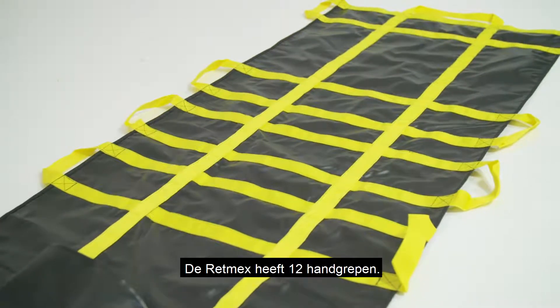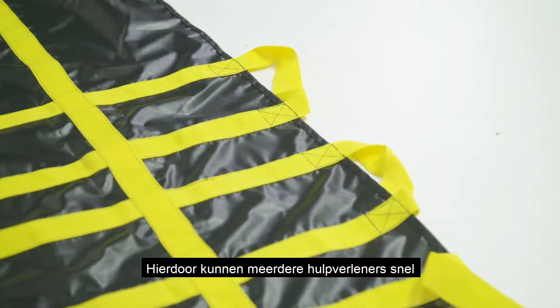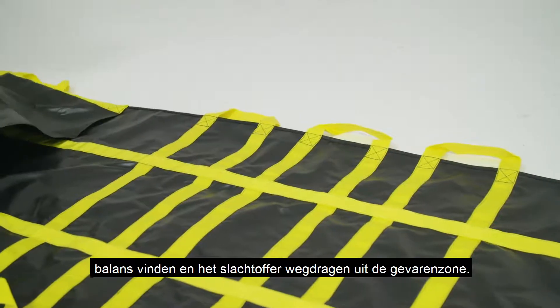The RETMEX Sheet has 12 handles, so multiple rescue responders can easily balance and carry a victim from the scene quickly.